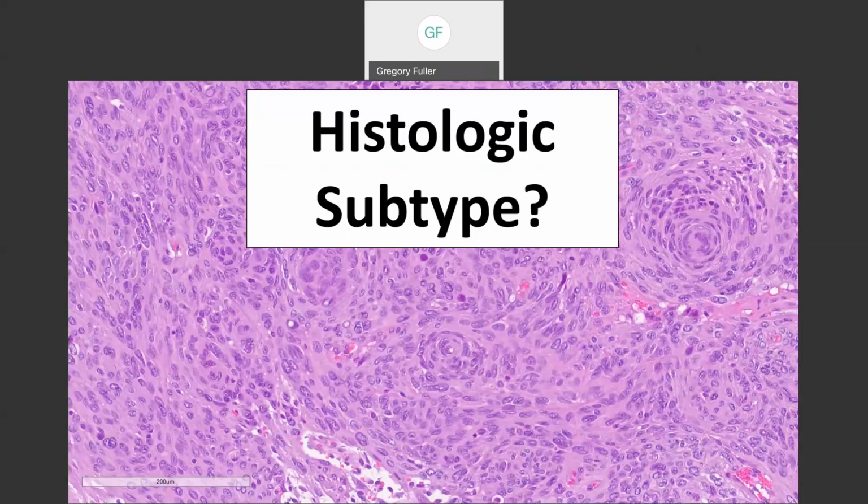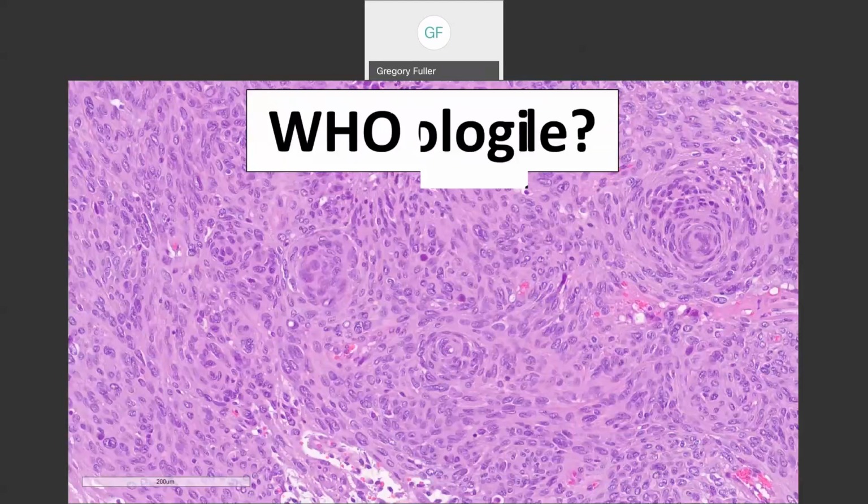So meningioma. Okay, what's the histologic subtype? Let's bump it up one. Believe it or not, this is something a lot of people get wrong, and I don't know why. Transitional, Dr. Alphatel. Yes, it's transitional. For some reason, people want to call this meningothelial. Meningothelial is syncytial. There's no whorls. It's like a sheet with no borders. Transitional, think of it as a transition between meningothelial, the sheets, and the fibrous, and if you swirl them all together.